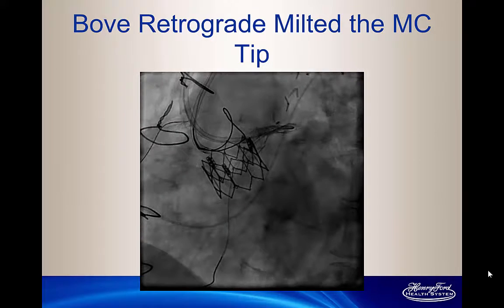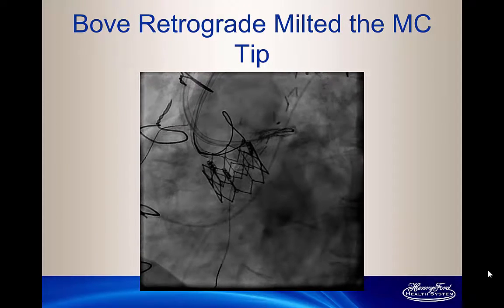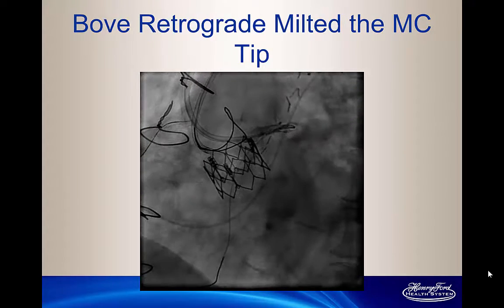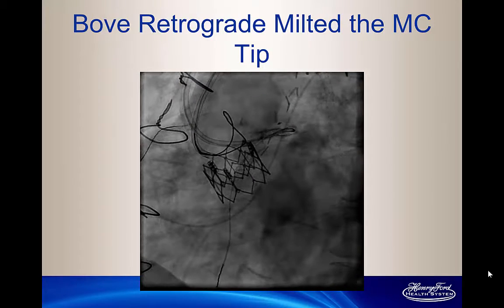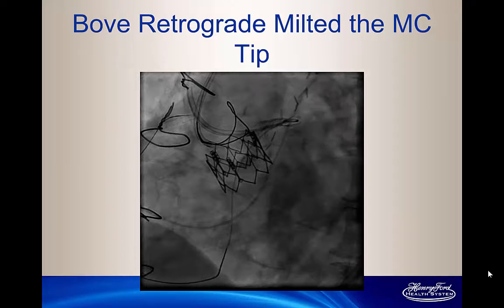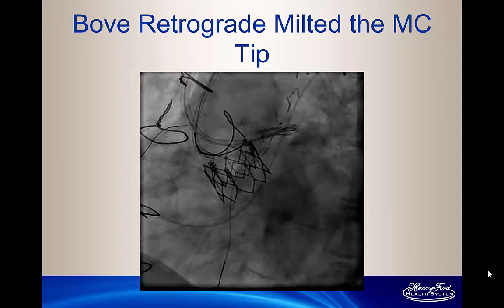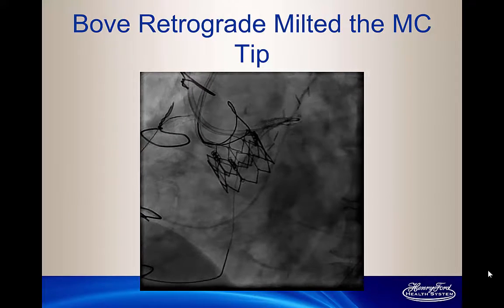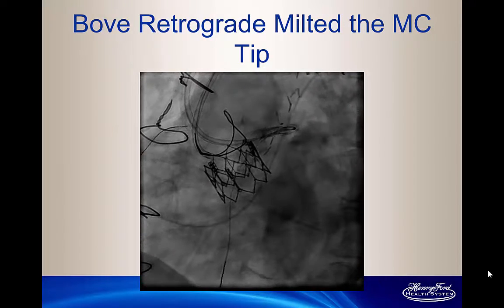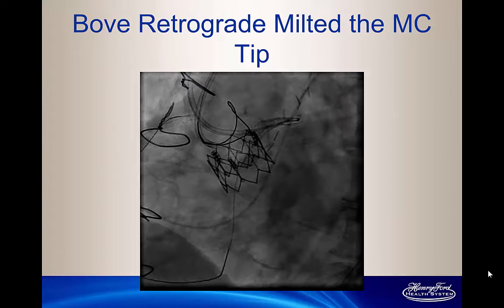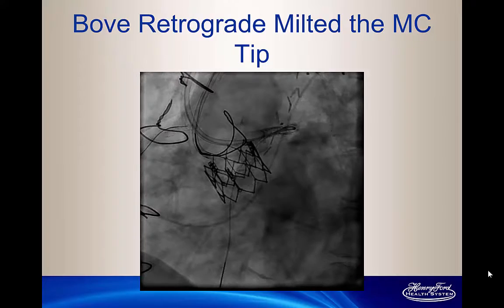Finally, I'm in a center with experience using electrocautery for puncturing from the IVC to the abdominal aorta for transcaval access. So I leveraged that experience — one of my colleagues came into the lab and we did this together. This is electrocautery activation, what we call bovie activation. If you notice, the tip of the catheter is melted away. This was a Corsair microcatheter, which has metal in it. When you use the bovie, the wire needs to be covered, and you should stay on the cautery for just a few seconds. We cut the tip of the Confianza Pro 12 wire to make it even more penetrating, but it would not advance. Instead, the microcatheter melted away and actually pushed back.